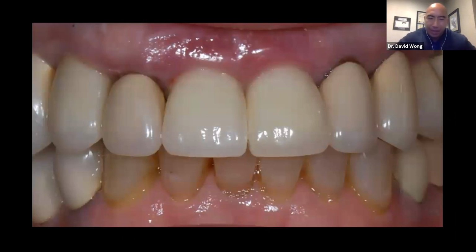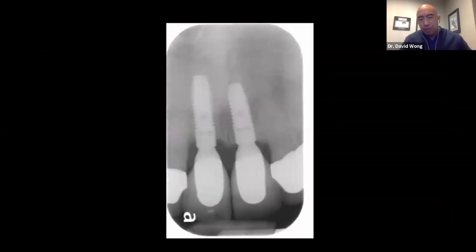And for me, I'm like, I don't know why that would be. It's 2 front teeth. All your other teeth, you do have some issues, but not the front teeth. What's going on? Those are brand new teeth. So let's look at the radiograph. You'll notice that we have crestal bone loss around the implant around number 8. And then clinically, if you recall, it's very, very inflamed, edematous, a lot of red, angry-looking tissue.